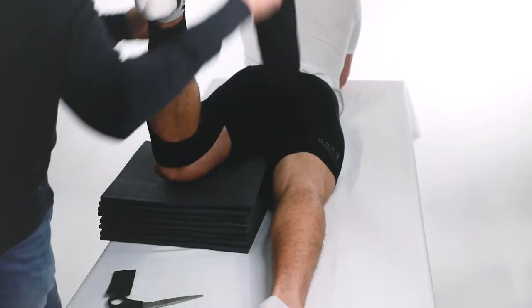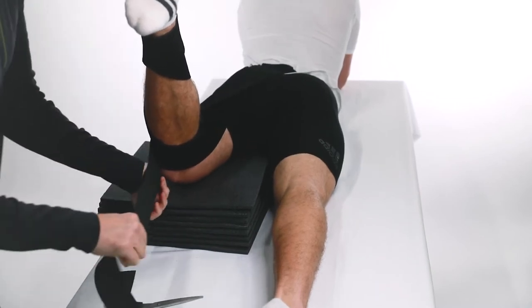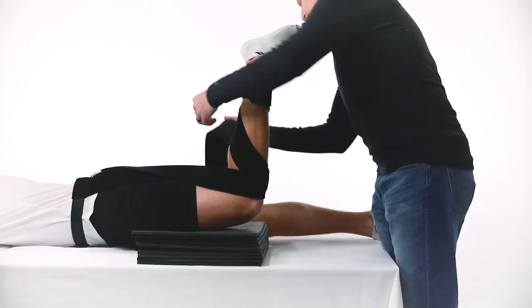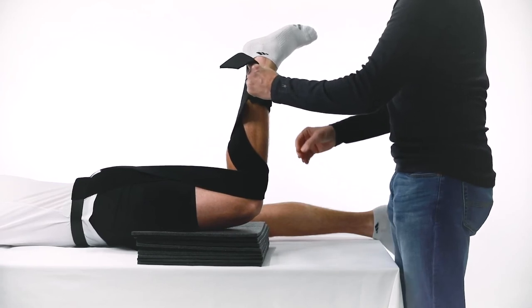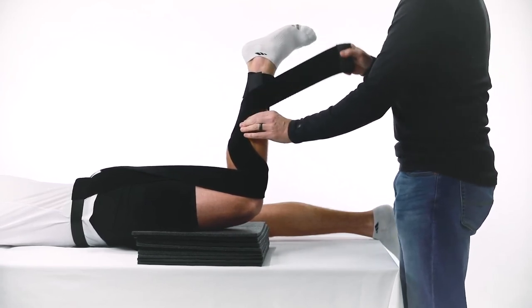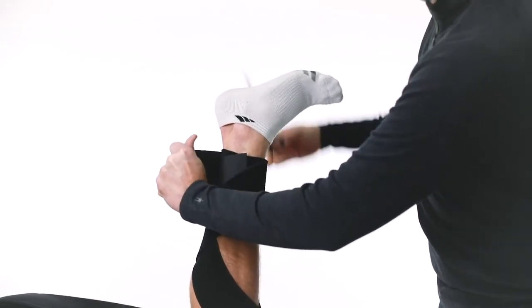Pull strap A toward the lateral side of the shin of the affected leg, crossing strap B at the hamstring. Pull strap A tight to remove slack and create tension. Pull strap A across the anterior of the shin just below the kneecap, then continue spiraling strap A down the lower leg, securing the strap around the ankle and over strap B with the attached hook and loop fastener, cutting off excess material of strap A if necessary.